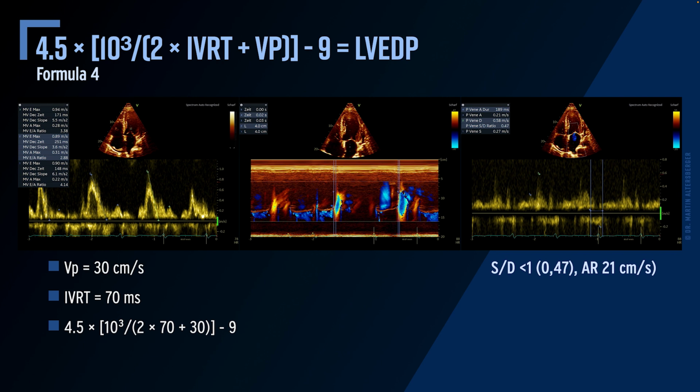And in this case, we do see an inflow into the left atrium via the pulmonary veins, and we can calculate also ratios there. And this S to D ratio, so we have an S wave and a D wave, shows when it's below 1 that filling pressures must be elevated. Also, we can measure another time interval. We can measure the atrial reversal flow, so the AR, and the time of AR as well. So we also can utilize more measurements as well.